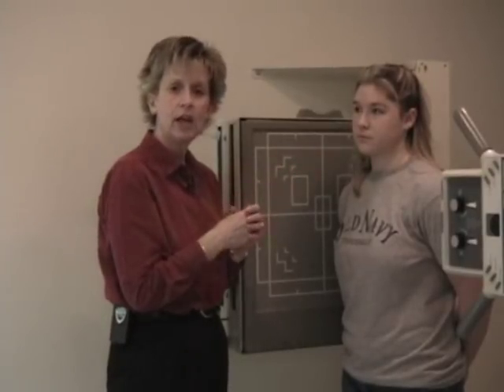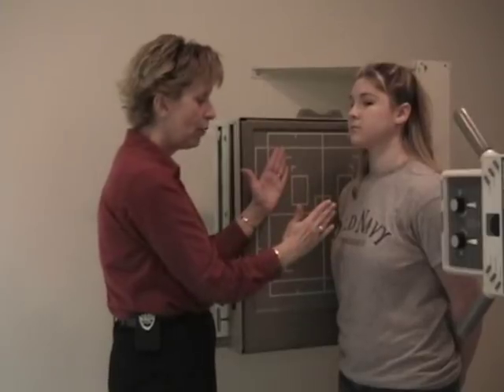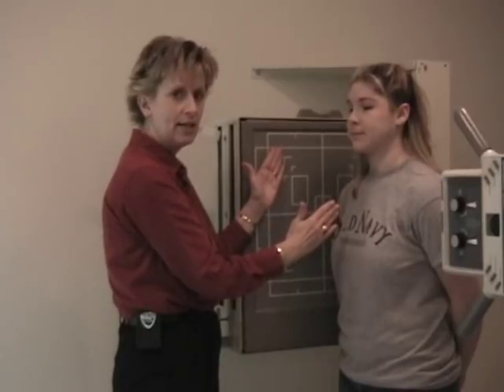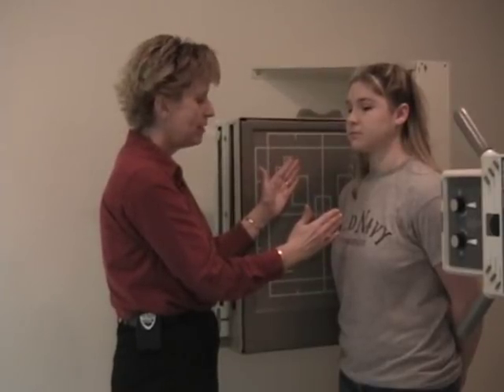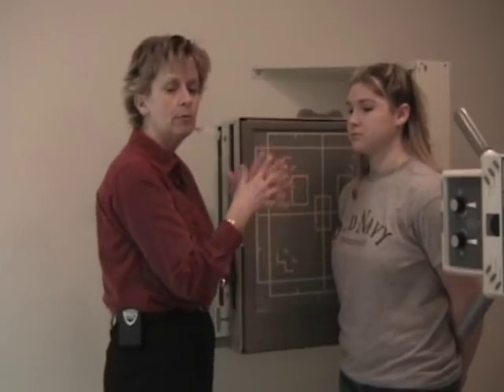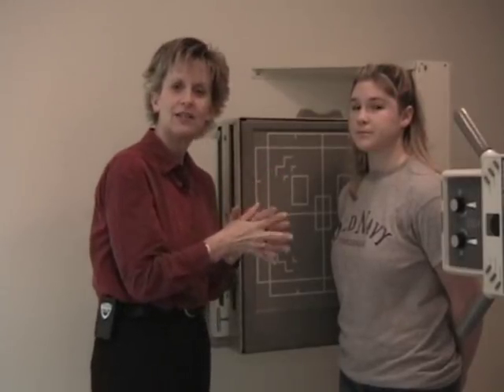Now, if you think of the rationale behind that, would that be good rationale for a lateral? Patient's in a lateral position, and the sternum is already naturally at an increased OID. You would not want to bring the SID in from the standard 40 because you already have OID, which is taking away from the resolution of the sternum, complicating your effort. So maintain your 40 inches for a lateral, no options there. And that concludes the lesson on the sternum.